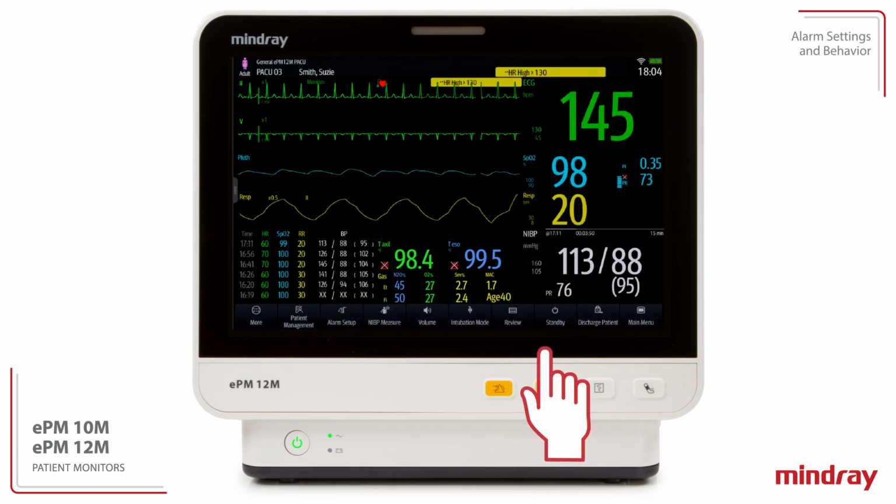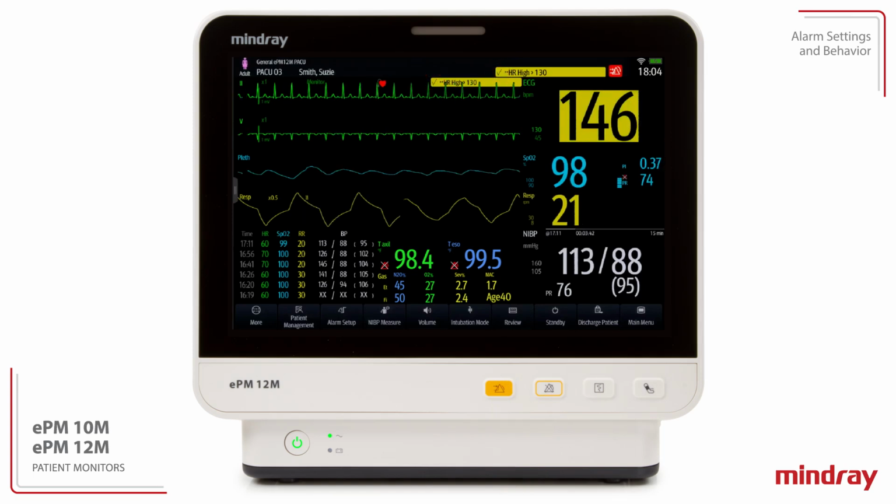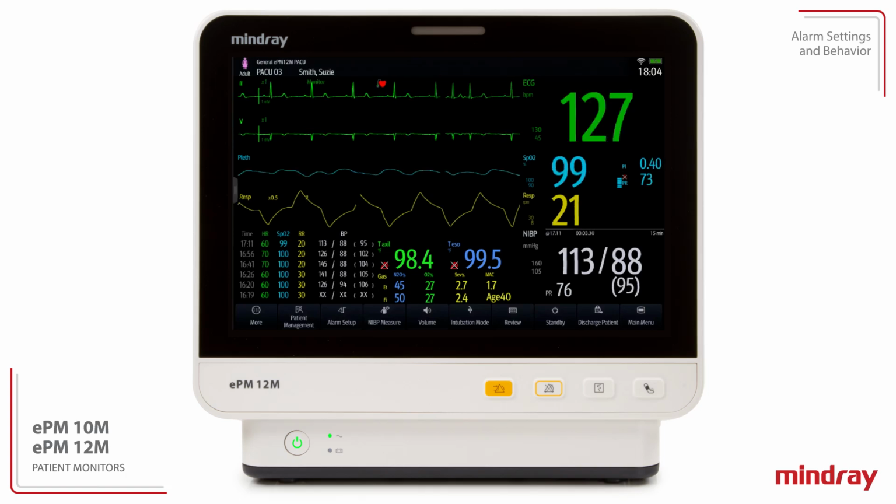The Alarm Reset key suspends the audible alarm for the duration of that alarm. The visible message remains displayed with a check mark until the alarm condition is resolved. If a new alarm occurs, audible and visible notifications will appear according to the priority level of the new alarm.